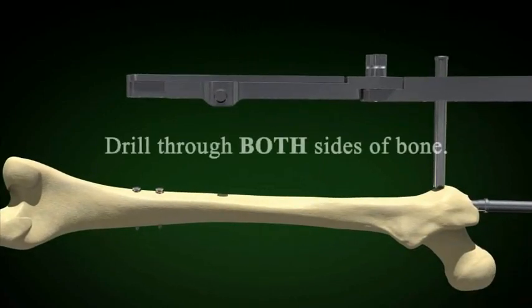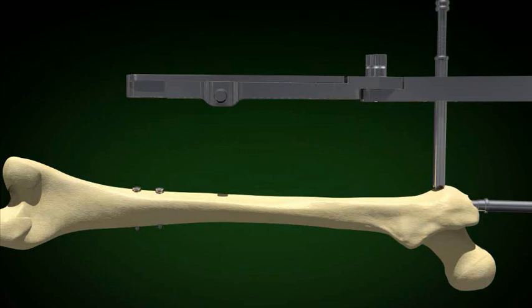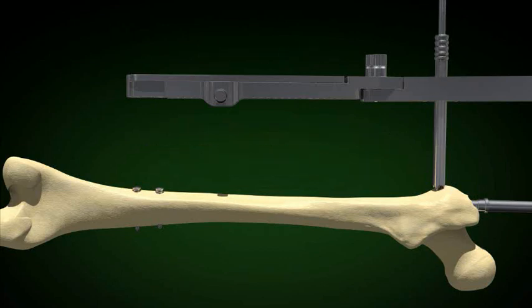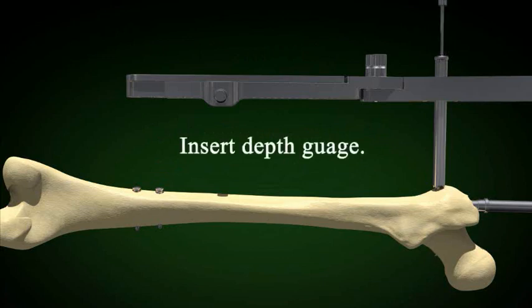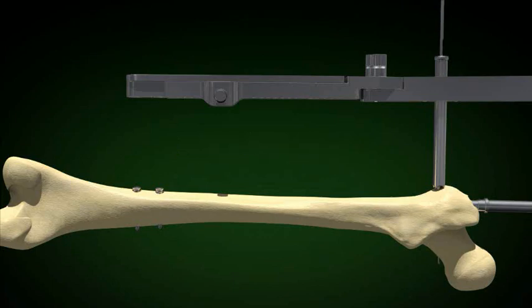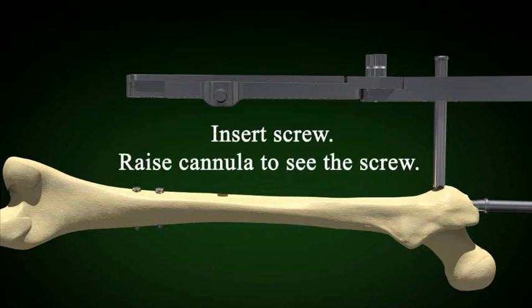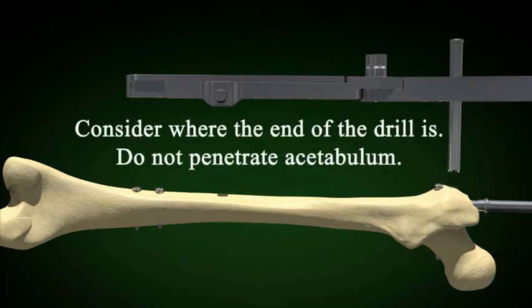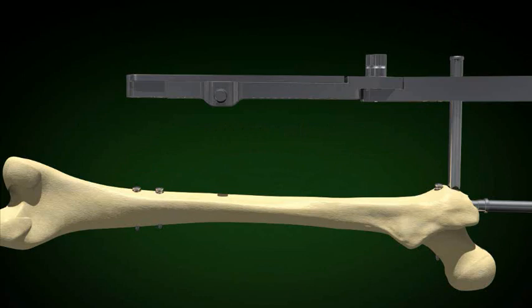The proximal interlocking screw is accomplished by drilling through both cortices at once. The step drill is used to enlarge the hole. Slot finders are not needed for the proximal interlock. The depth gauge is used to measure the length of the screw — add five millimeters so the screw will extend two threads on the far cortex and two threads on the near cortex. Raise the cannula to see the screw proceeding, as the bone is thinner in the greater trochanter than in the diaphysis. Consider the position of your drill bit so you do not penetrate the acetabulum.